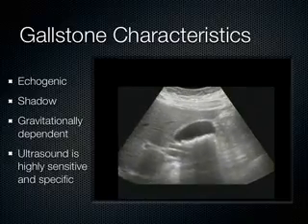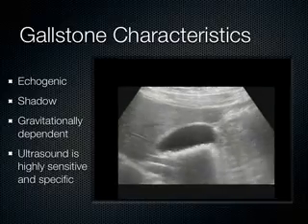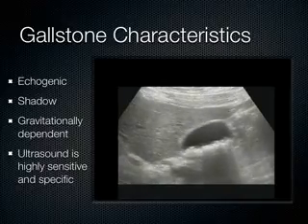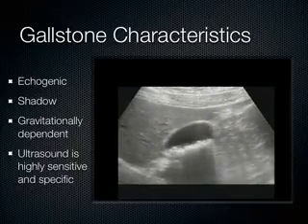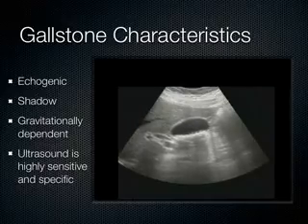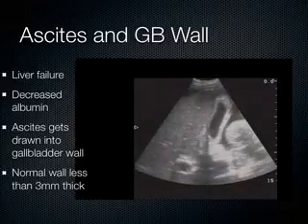It beats out CAT scan because with a CAT scan, you miss on that one little cut, you miss the gallstone. And I've got plenty of examples of that from the literature and anecdotally, where ultrasound found stuff that the CAT scan missed, especially when it comes to gallstones. And this is just another example here of the gallbladder wall.